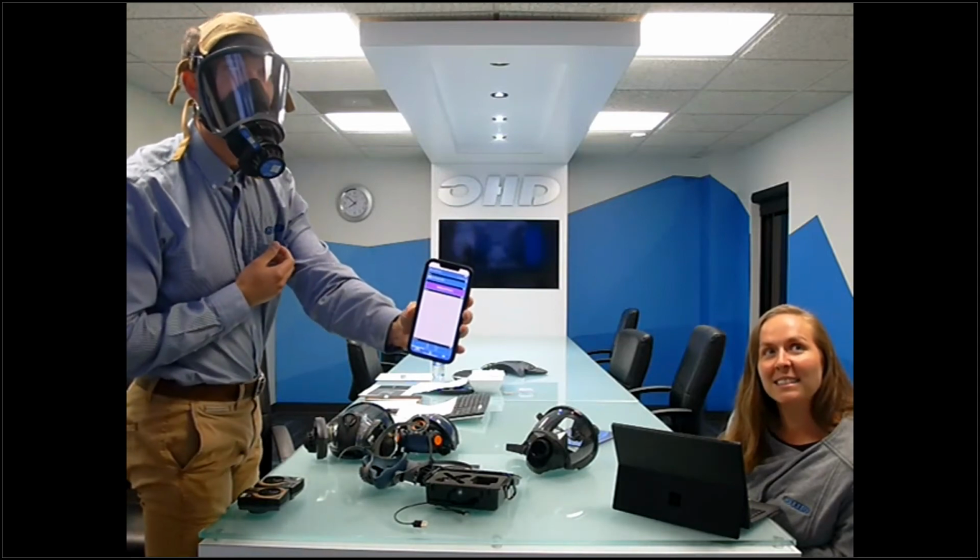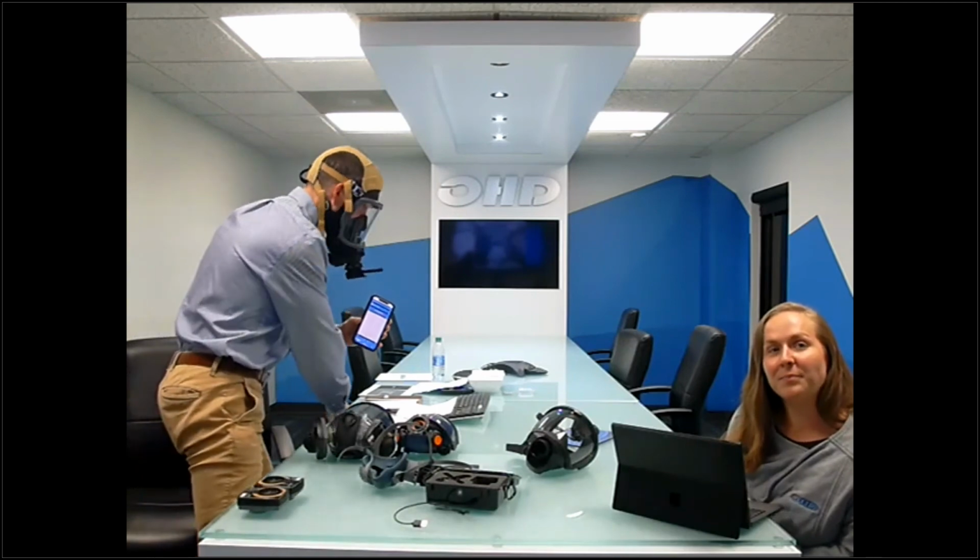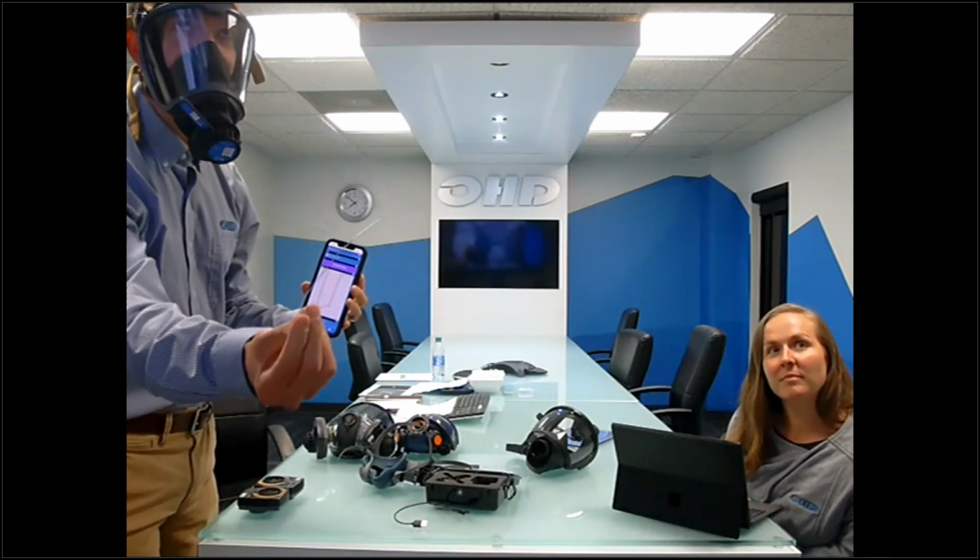So you got a pass. Mask is fitting well. So I'm going to now introduce a leak.